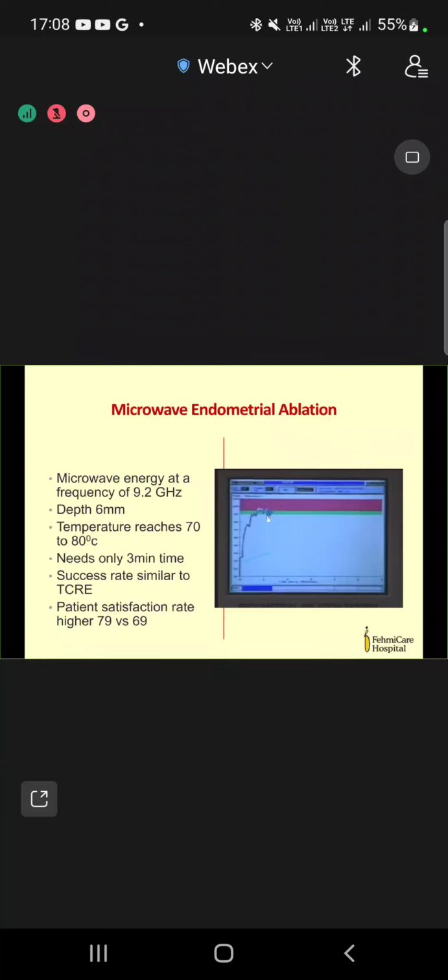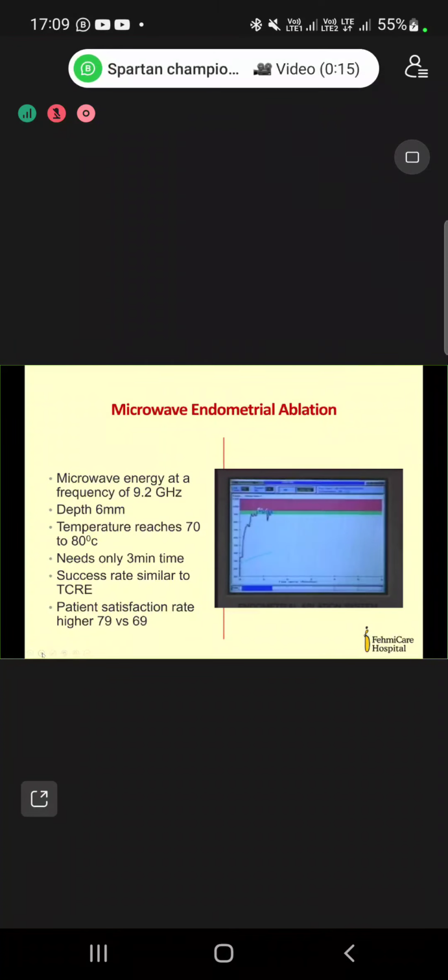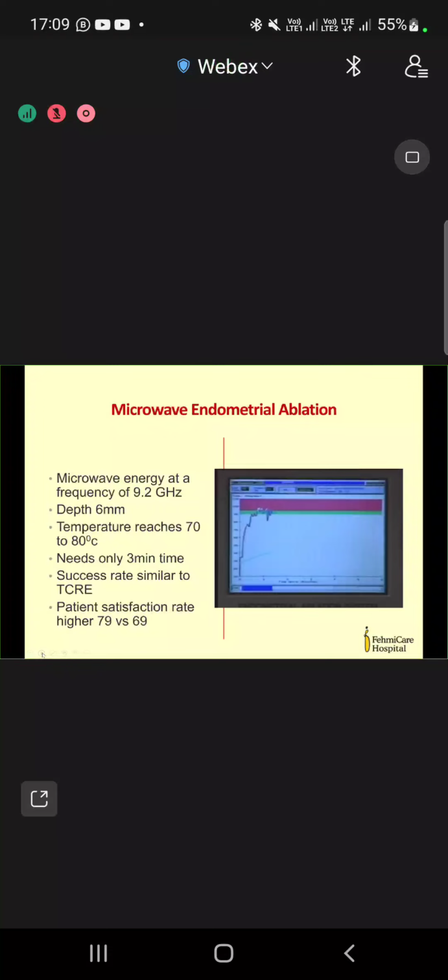So when it dips below, you have to keep the probe there in the same place for a few more seconds. Then your probe will give, you have to be in this area. If it is going beyond that and going to the red zone, start moving your probe. In one case, doing hands-on, you can learn this technique. That is what I felt. If it would have been there, it would have become very popular, because many people very quickly, in 1 or 2 cases, learn the technique. But the cost was very, very expensive.